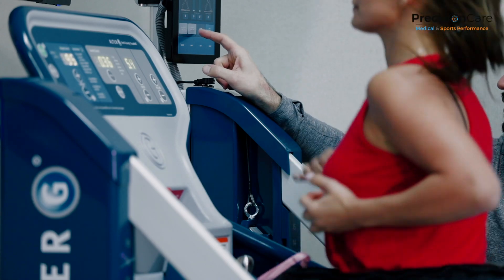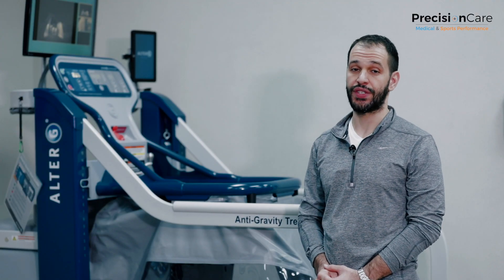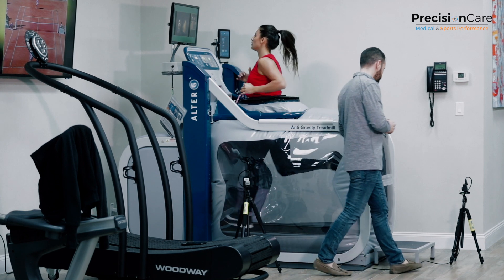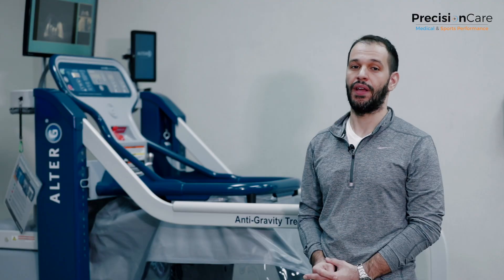Along with physical therapy, we're able to get our patient into this treadmill and walk her through the process. The treadmill allows us to take the patient's body weight and reduce it while maintaining or increasing their speed. For instance, if a person weighs 100 pounds and we take 20% of their body weight off, they're running as an 80 pound person. The treadmill allows us to take up to 80% of someone's body weight as they're running.